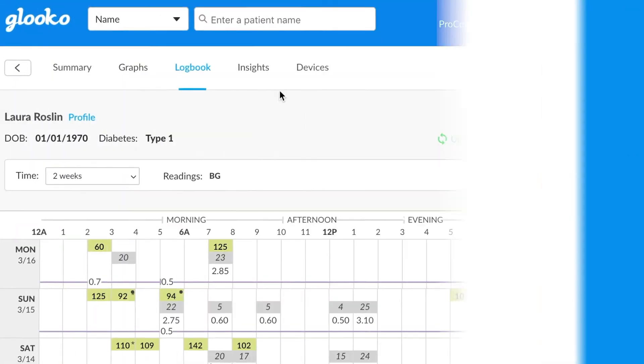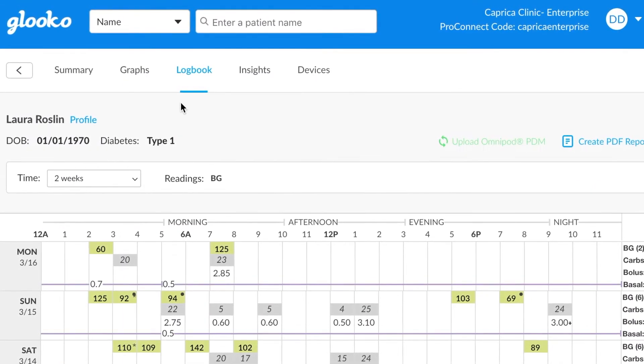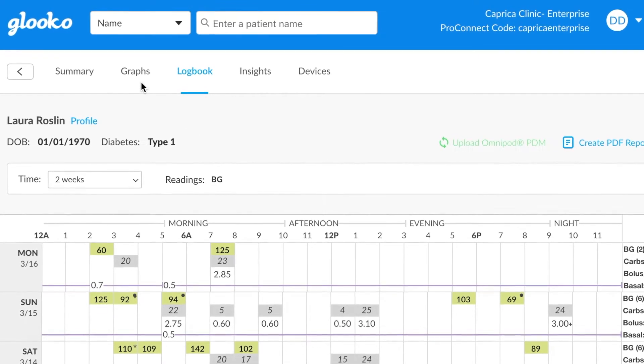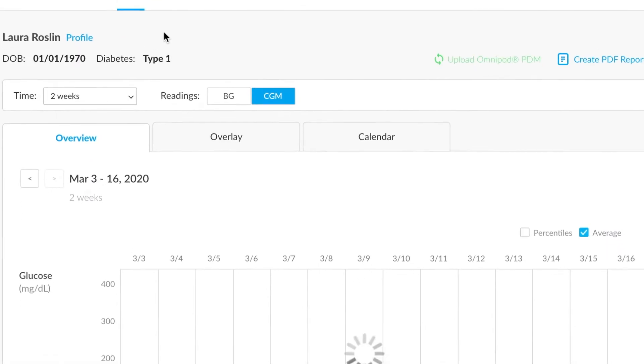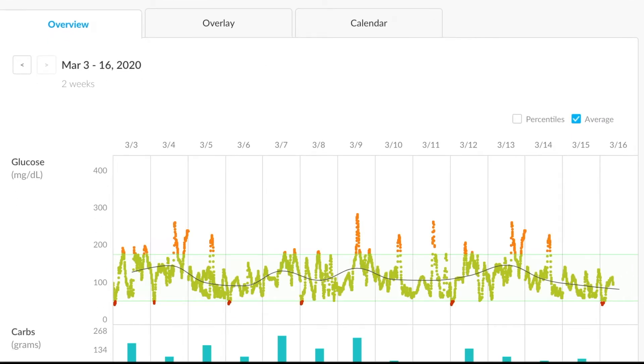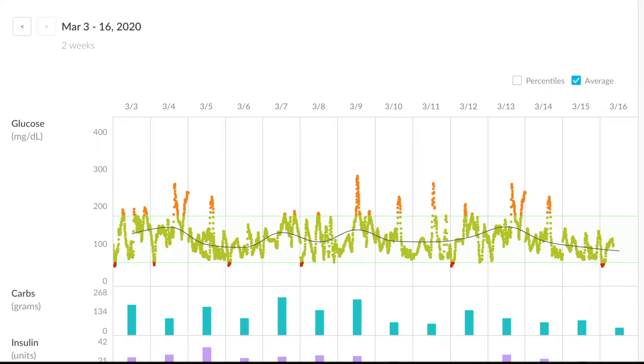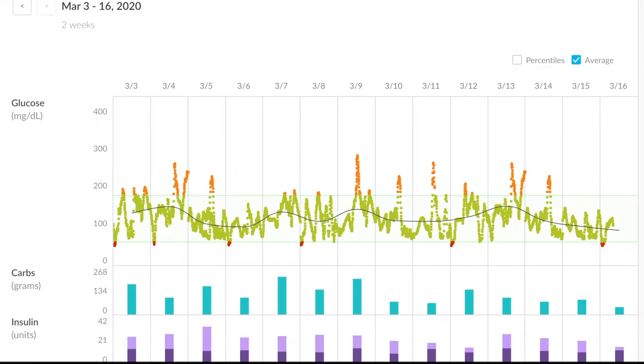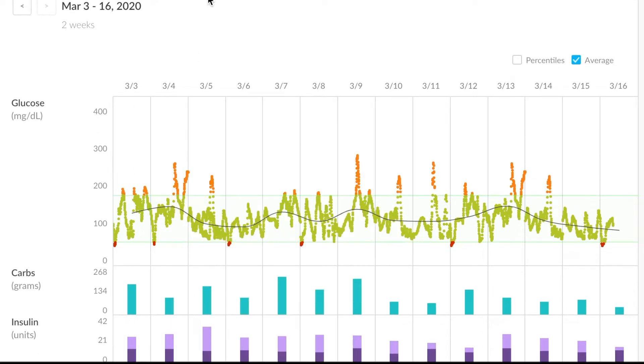Another useful view that we have available on Glooko is this graphs section. If we click into that, you'll see that it gives us more of a graphical representation of the information. You'll find a lot of the continuous glucose monitors, the CGMs of the world, displayed here, and it gives us a better indication of long-term trends and data over time.